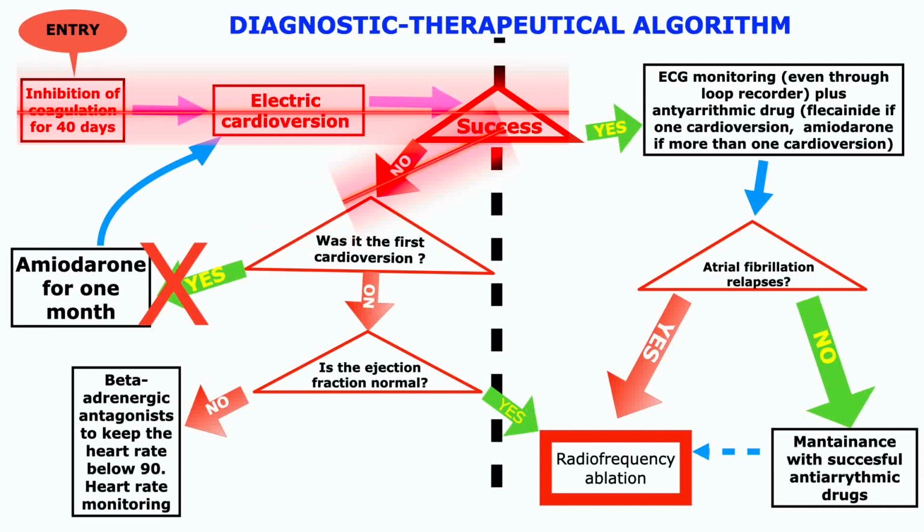The radiofrequency ablation was supported by 3 facts. 1. Heart failure recovered. 2. Volumes of the heart chambers decreased and ejection fraction back to normal. 3. No atherosclerosis risk factors. Normal low-density lipoprotein cholesterol, no smoker, no hypertriglyceridemia, no diabetes, no overweight.